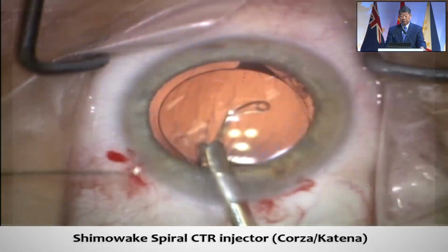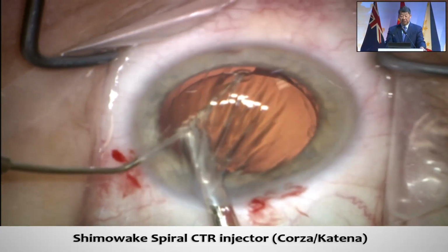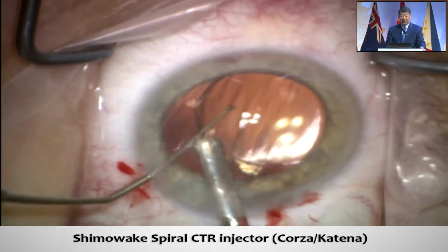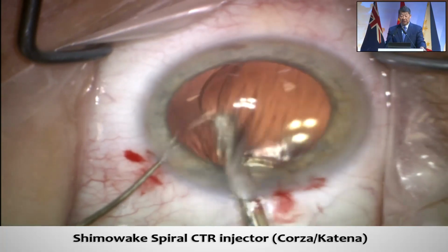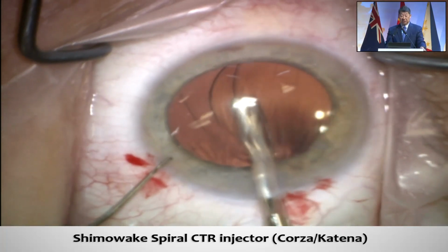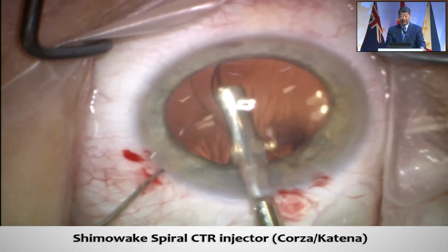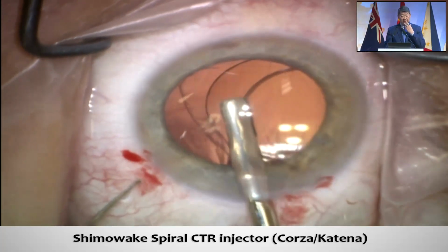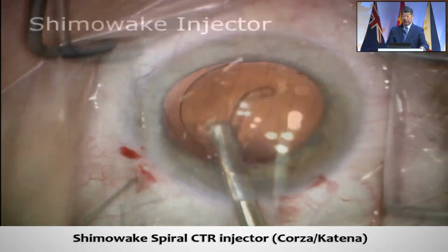All right. Now, look at me trying to put in the CTR. I know it's going to decenter the bag, and look at the zonular dialysis. There's no zonules down and to the left. My goodness, I cannot get this in. If I persist, I'll dislocate the whole thing, and I have to come out. This is a dead bag syndrome.